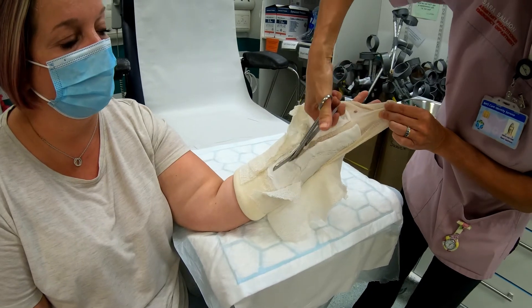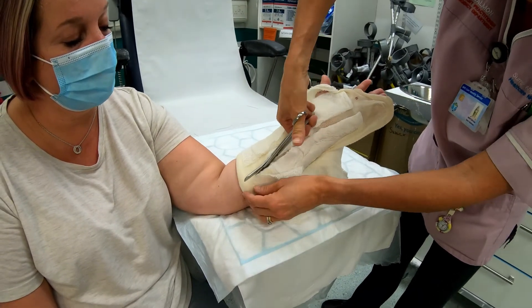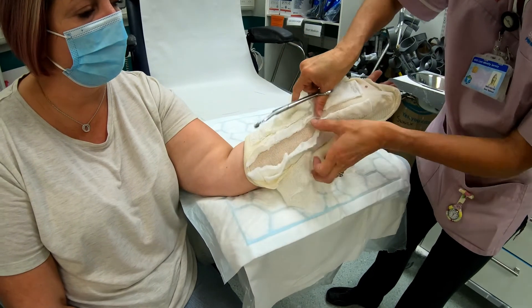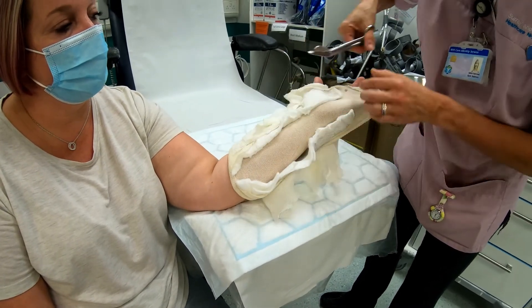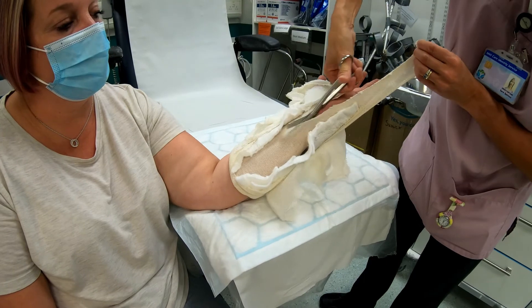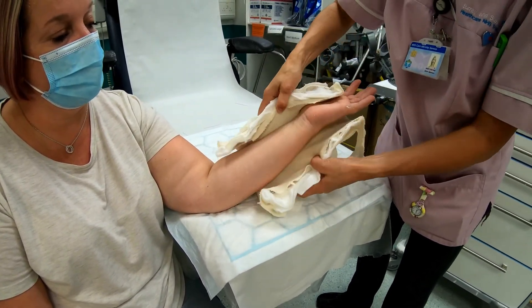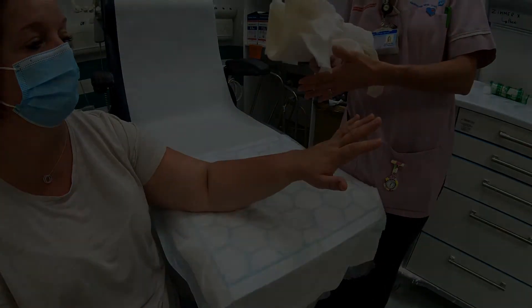Hold on to it and it will just nicely cut down like that. You can then bend it slightly and cut the sock. Just make sure you do it in individual layers.